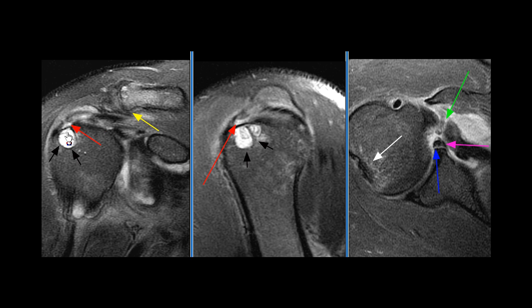Supraspinous tendinosis is seen with a partial articular surface tear. There is delamination of the articular surface of the distal supraspinous tendon. A footprint erosion or cystic change in the adjacent greater tuberosity of the humerus.